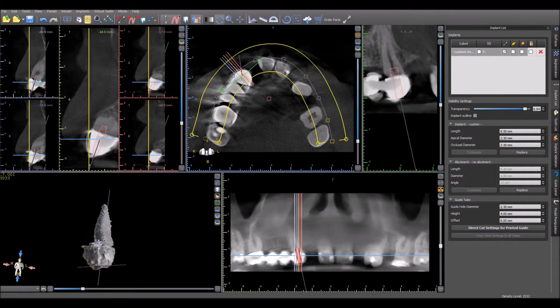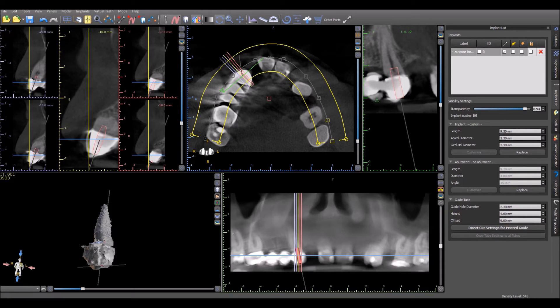Keep in mind that the drill depth at which the drill will bottom out is the implant length plus the offset. These two numbers can be adjusted to adjust the drilling depth.